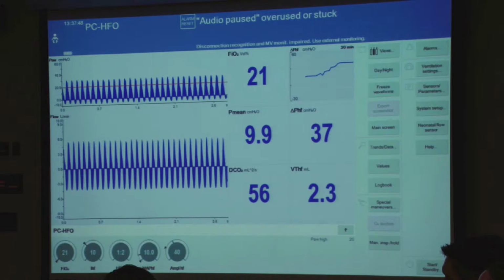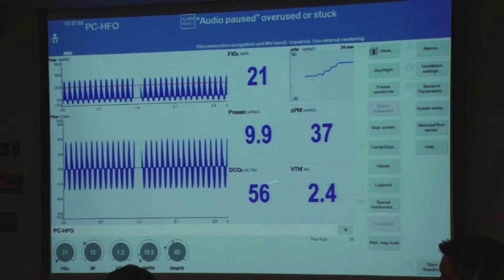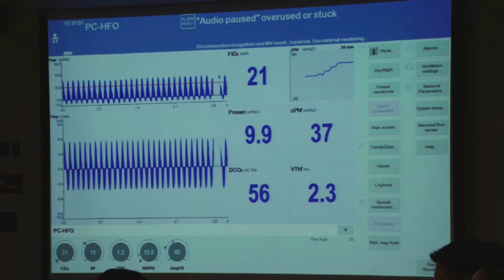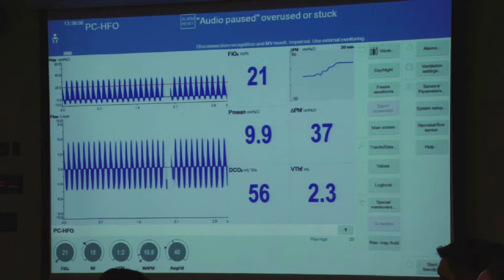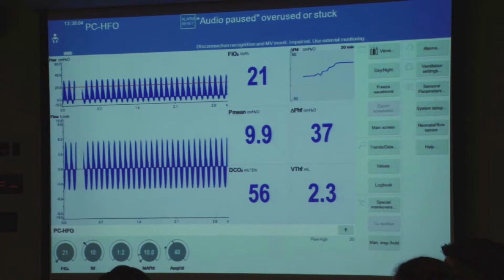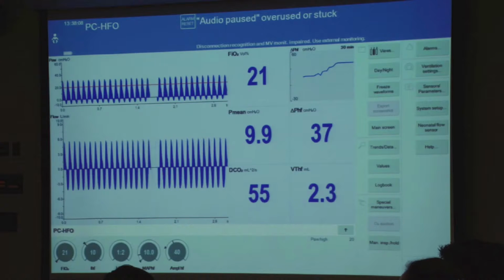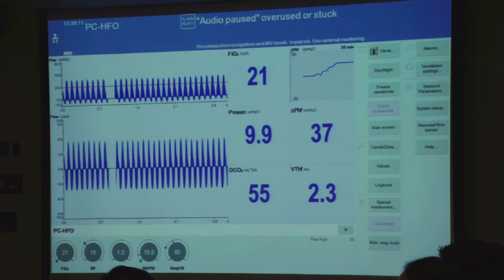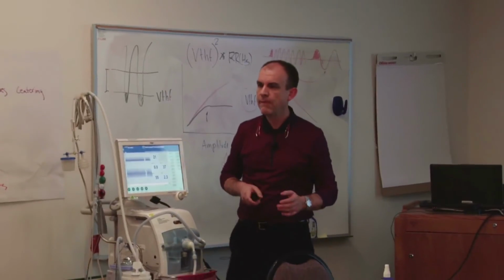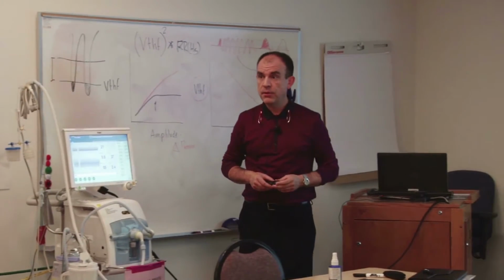And there isn't a strict relationship, I mean, there is a relationship between these two parameters, but it's dependent on the lung, the airway, the baby in particular. So what for this baby reaches this amount, for another baby it might be completely different. The hertz, when you adjust the hertz, what is the lowest that you go? As far as 6.